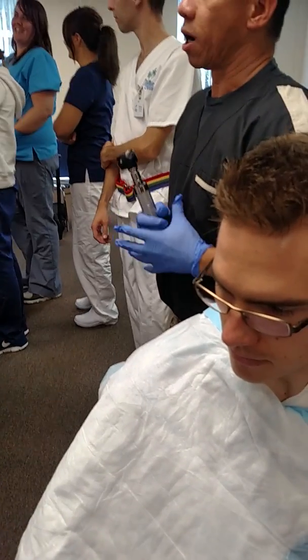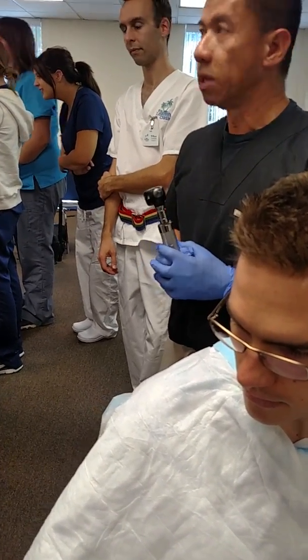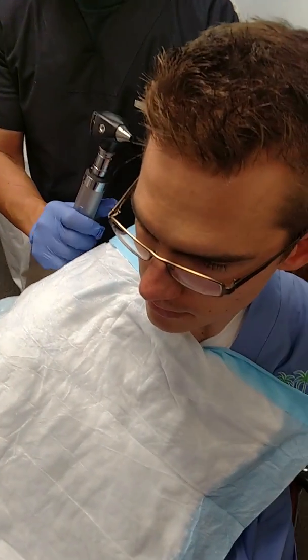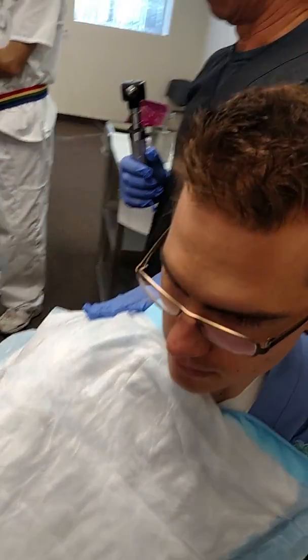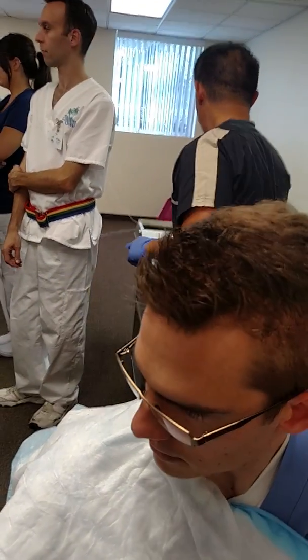So anything for the doctor's order, or if the ear requires some irrigation. So again, the doctor will have to look at it again to see if it is clear. Before you discharge the patient, you want to make sure that the doctor looks at it. All right? You can also use the syringe that Fernando is showing there.